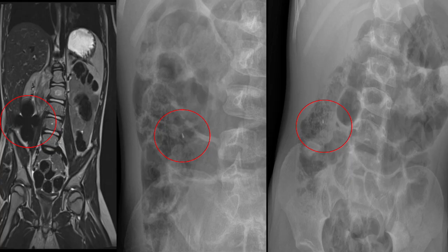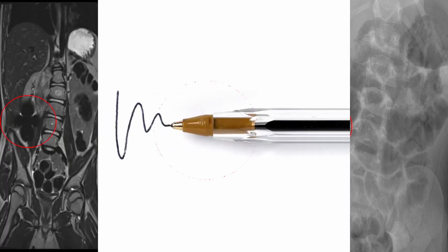This next case, again, a recent one, we've had a little spate recently. This, again, same sort of artifact, susceptibility, no history of surgery. So again, we brought the patient off, did an x-ray in a couple of different positions just to be sure, had a close look, and then I realised exactly what that is. This is the pen nib. So this patient had swallowed a Bic pen nib.